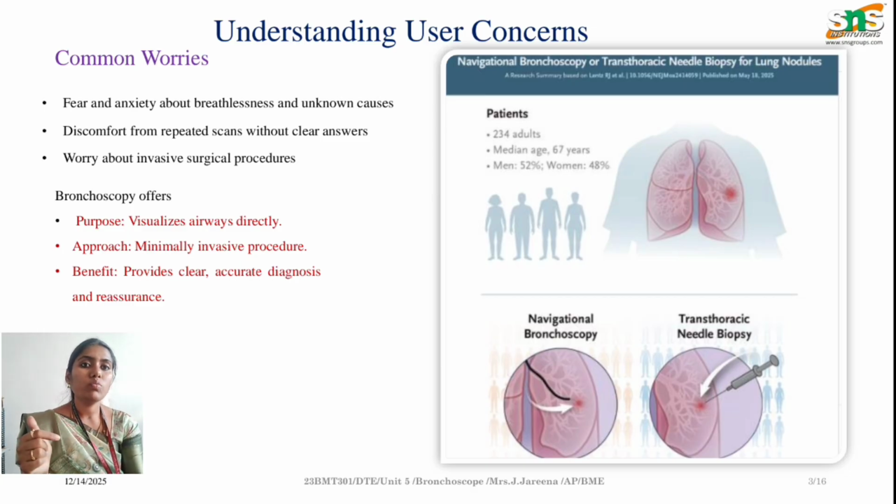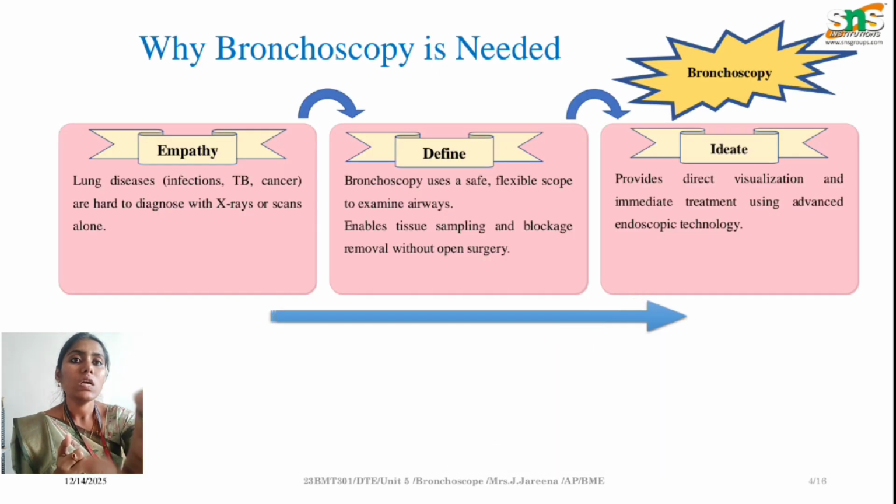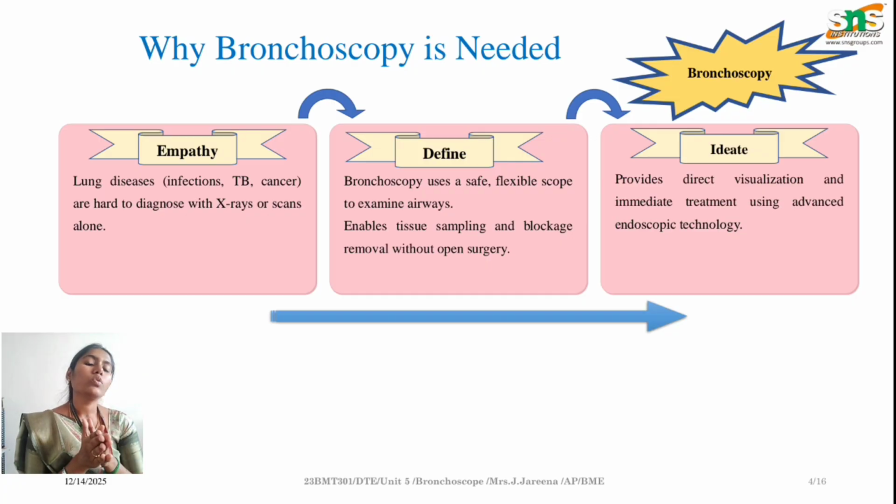Next to the trachea, we have two branches, followed by the right lobes and left lobes of your lungs. So we will have a total visualization from the airways, trachea, bronchi, alveoli, and so on. The benefit is that we have a very clear examination and visualization of your total respiratory system, which highly supports diagnosing the problem accurately, and also gives very good treatment and follow up.